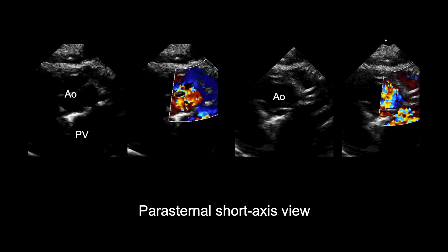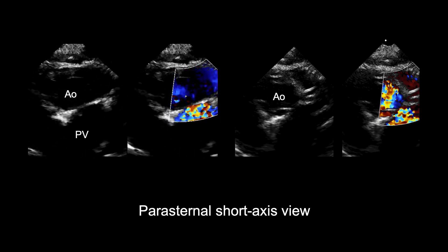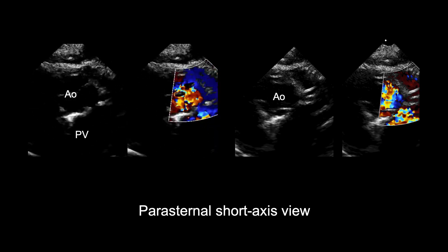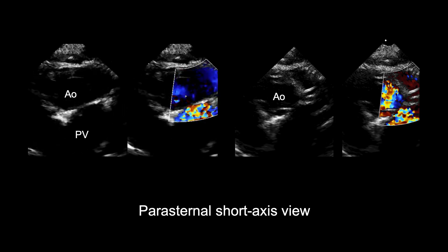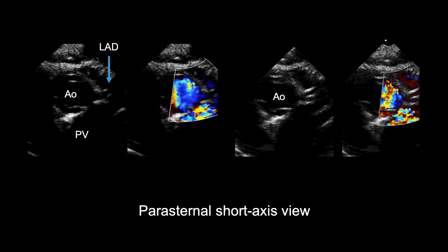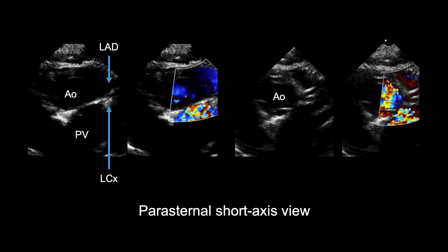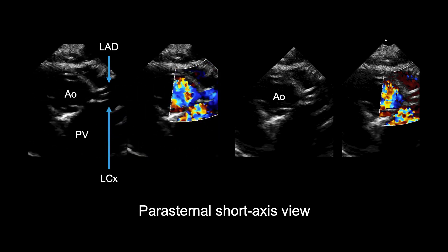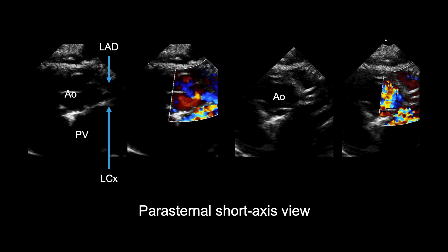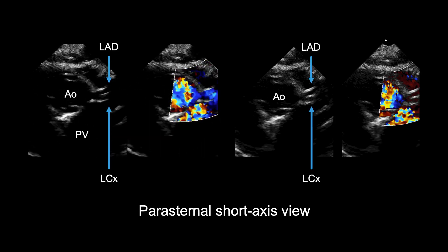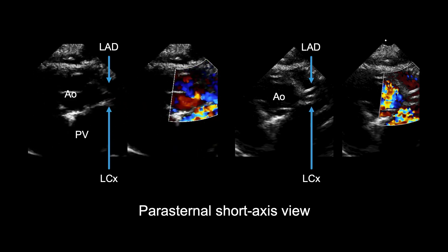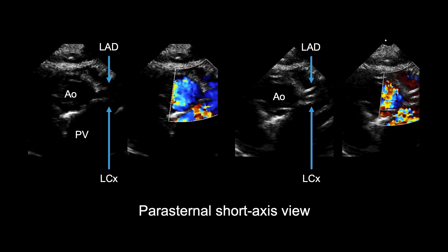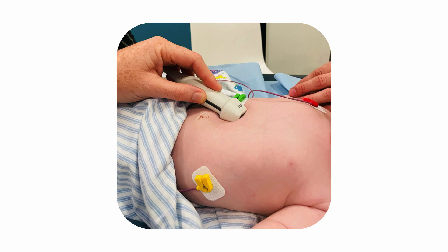This parasternal short axis image shows the left coronary artery origin arising from the left coronary sinus, then bifurcating early to give off the left anterior descending (LAD) and left circumflex arteries. It is usually helpful for coronary imaging to acquire a moving image first followed by a still image, as the coronary arteries can be difficult to appreciate due to motion of the heart. It's also helpful to assess the coronary arteries in different imaging planes such as subcostal views to further confirm their origins.